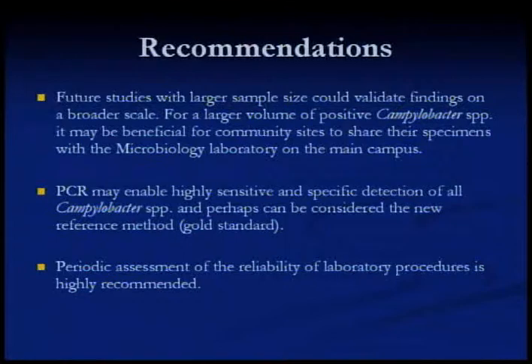In the future, it's highly recommended to continue this study with a larger sample size, which can validate the findings on a broader scale. For a larger volume of positive Campylobacter, it may be beneficial for community sites to share their specimens with the main campus laboratory.